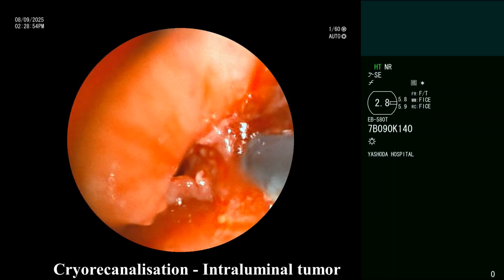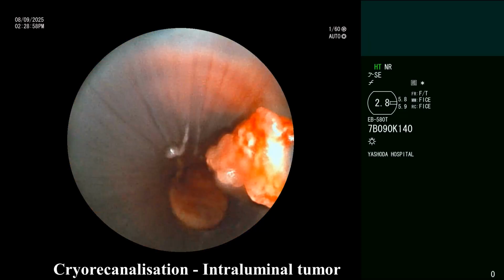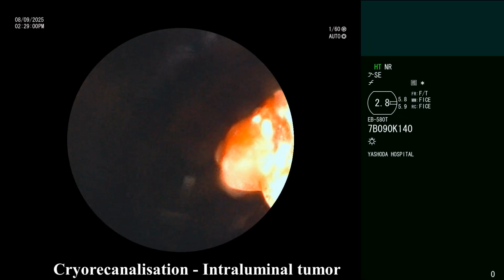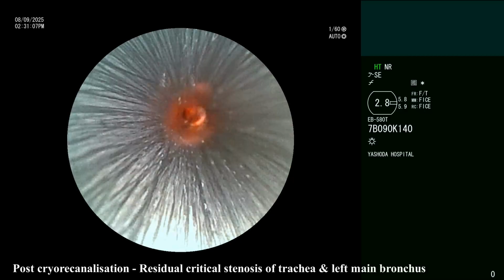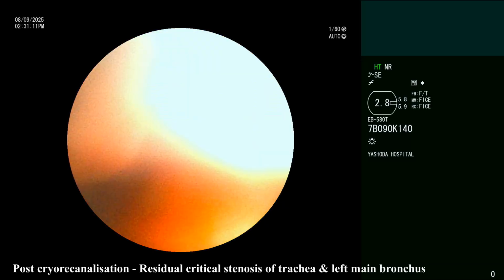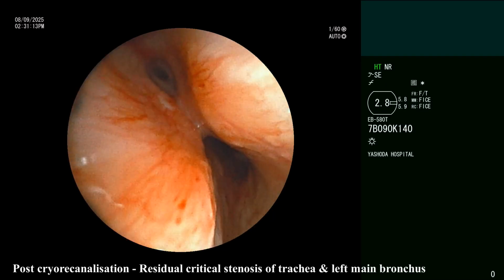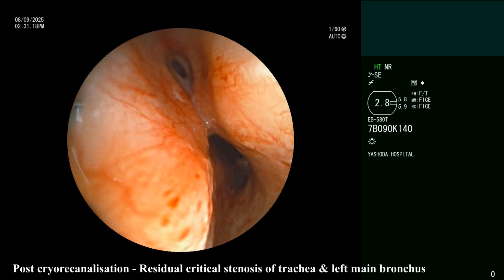Now a cryoprobe is passed through the bronchoscope and the initial tumor fragments which are causing an intrinsic obstruction of the trachea are removed with the help of cryoextraction with a 1.1 millimeter cryoprobe. And once it is done, now we are passing the bronchoscope and you can see there is still an element of a significant airway stenosis despite cryoextraction of the tumor segment.